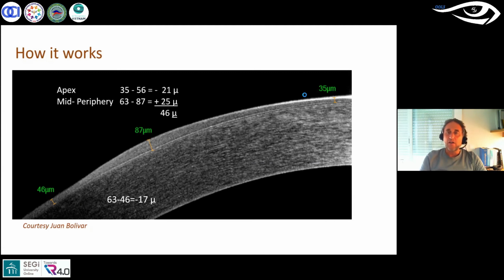It's not only a change in the central epithelium, it's both central and peripheral. That's why the reverse curve that is landing in that area is creating that accumulation of cells there, and dramatically changes the shape. And this change of shape, that is curve, changes the ray tracing that is going to the cornea and going to the retina.